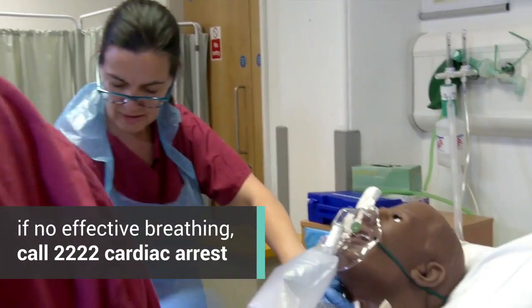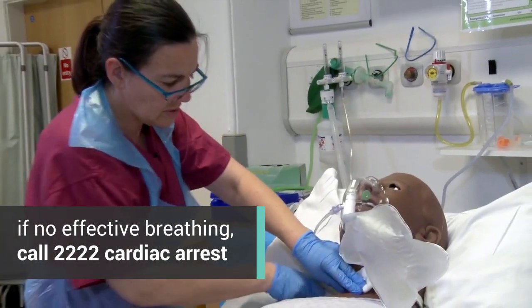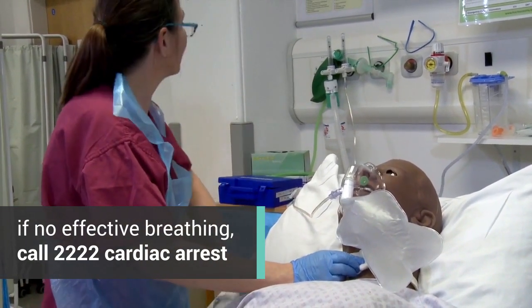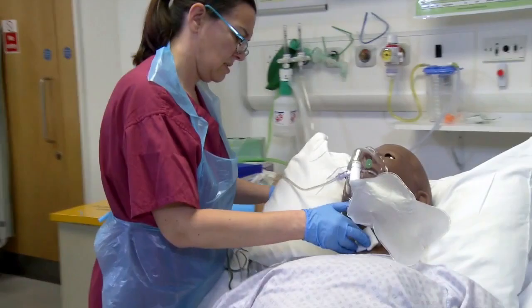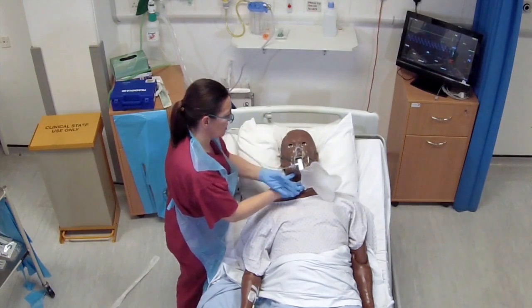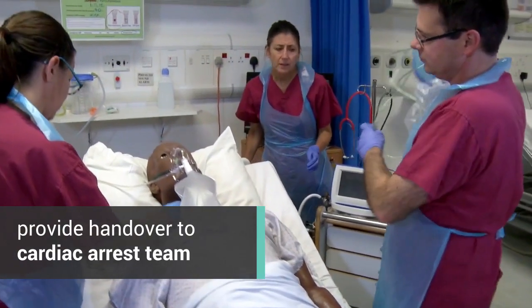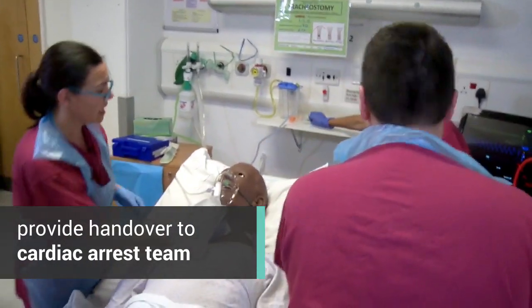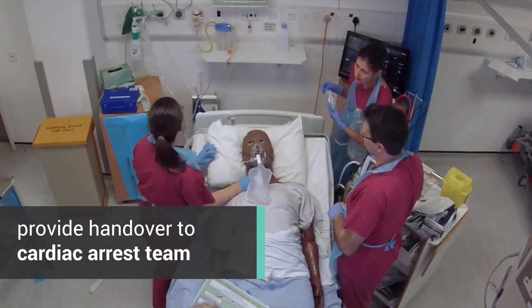I'll make a cardiac arrest call then. Okay, Robert, just keep breathing. This is Robert Smith. He had a tracheostomy back in November. We put him back to bed about 20 minutes ago and the tube was totally blocked. I've just removed it and he's desaturating still — we're at 85% on 15 litres.